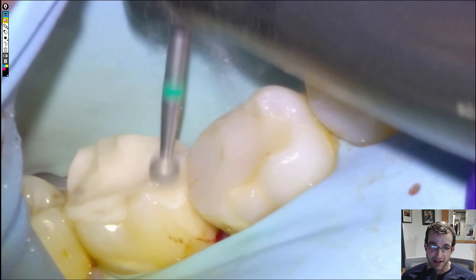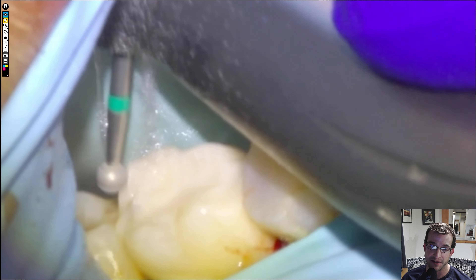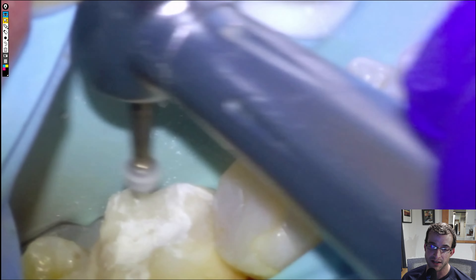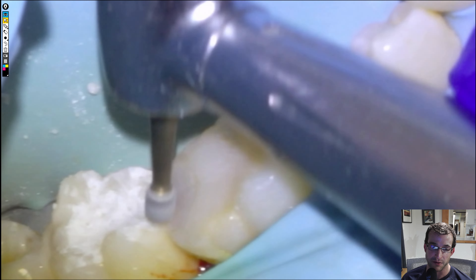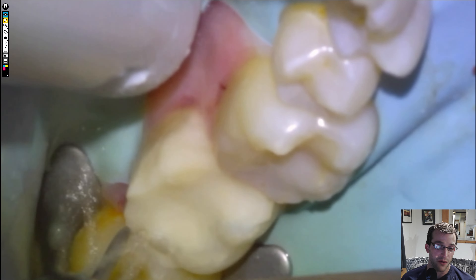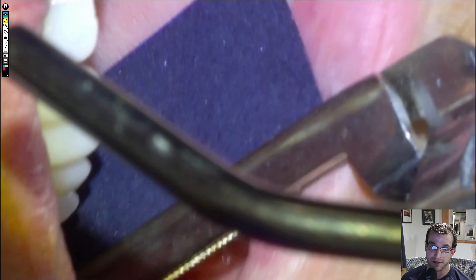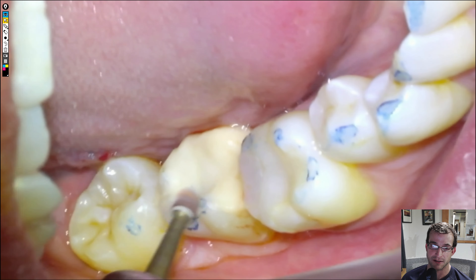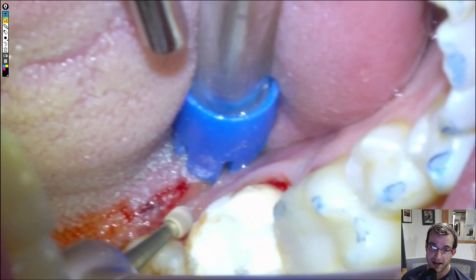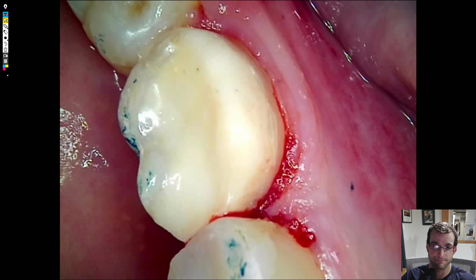Back to normal anatomy. We'll tell the patient that there's a chance of developing pulpitis, although we got fortunate here so far, and probably a crown is a good idea as well. This was just a spec that we did and he just wanted that one tooth fixed, but I would imagine that this will do quite well in the long term. Take the rubber dam off and check the bite. Once we're happy we'll check the contact and then coat it with the varnish, and that's going to be it. Here's the final.